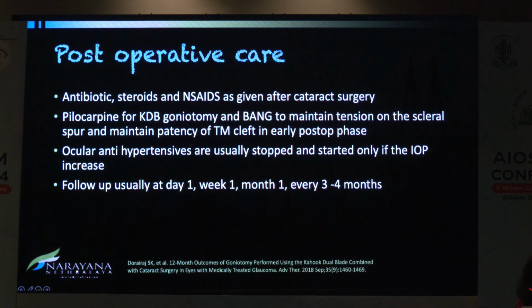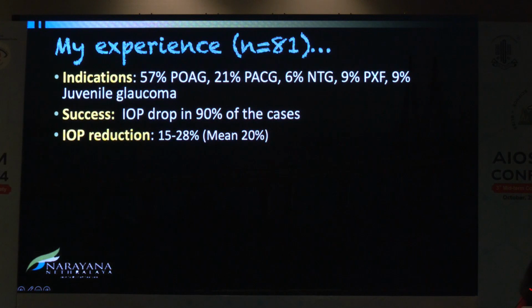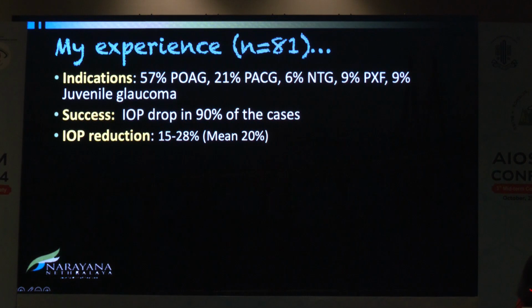Follow-up is usually at day 1, 1 week, 1 month, and every 3-4 months, like for any glaucoma patient. Post-operative gonioscopy should be done to visualize the implant or see the cleft, so as to understand whether your surgery is working or not. My experience is very little at this moment.